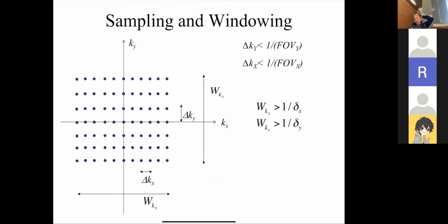Or, is it possible to do the sampling and windowing part in a time resolved way? I don't know if that's the correct terminology, but if you could use an echelon or something in microscopy to move the pulses in time so that each of the windows or each of those flips is at a different time. I don't know.